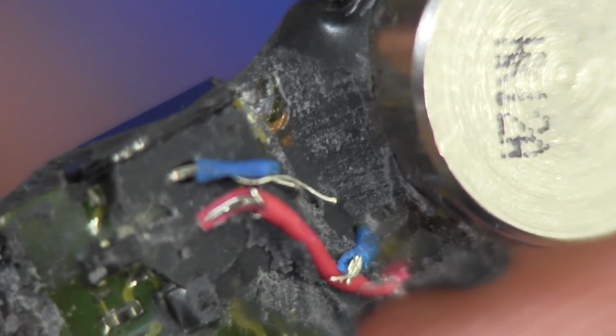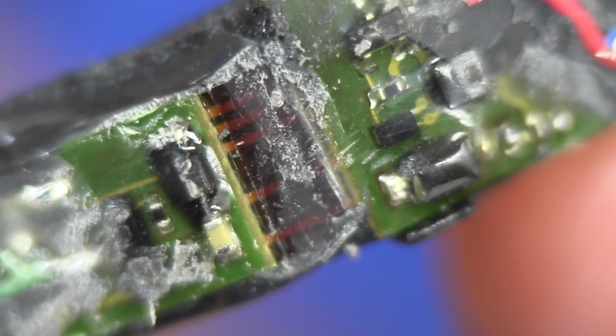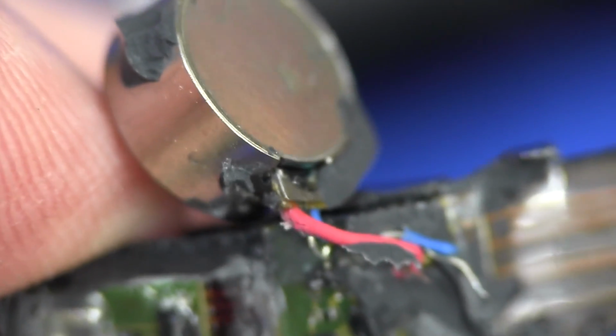You can see a couple of wires in, and I think I see another flex membrane underneath that. So man, it's like they've gone to a lot of trouble. They've got like 5 separate boards in this thing. And there we go, there's the flex membrane. That's under the accelerometer there. There's the accelerometer. You can see the 2 connections on that wired in.